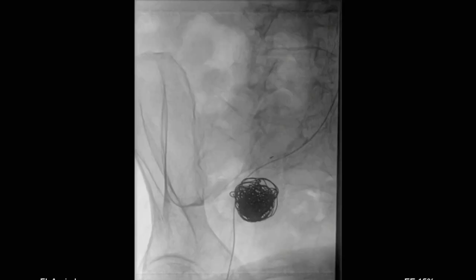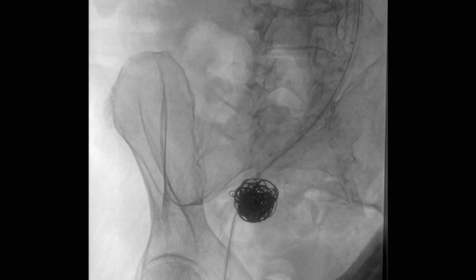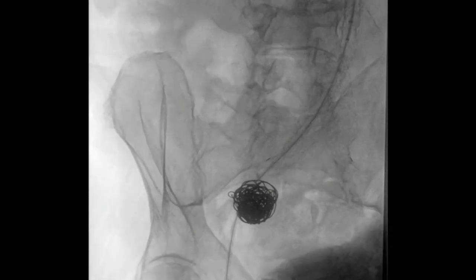At this point we decided to get retrograde access, so we now have a 7 French sheath up into the common iliac. The reason for this is that we're going to place the VBX between the end of the previously placed Aorfix graft down into the external iliac. It also adds a little bit of safety should you have any problems with the coil — you can be pretty aggressive in packing the coils knowing that the origin is going to be excluded.